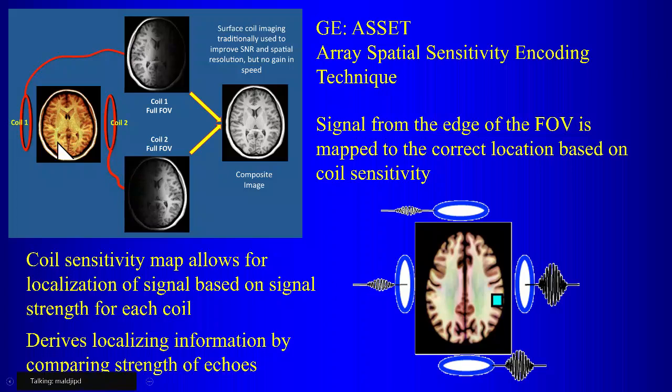It turns out that there are multiple coils that you're acquiring data from, right? There are coils on each side. The anatomy that is closest to the coil will give you the highest signal. If I were to generate an image just from this coil, this is the image I would get, because the anatomy closest to the coil is going to give you your highest signal. That's why if you look at MR images, it's so bright right underneath the coil, okay? Because this anatomy is very close to the coil, the signal is going to be highest. That's what the image looks like.